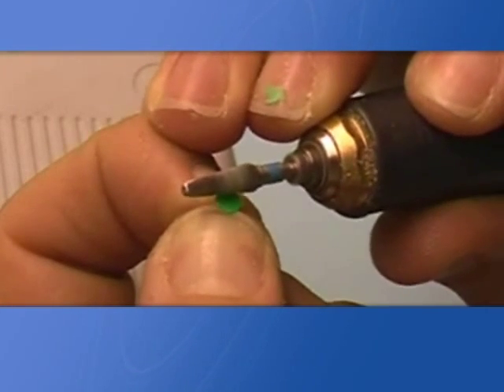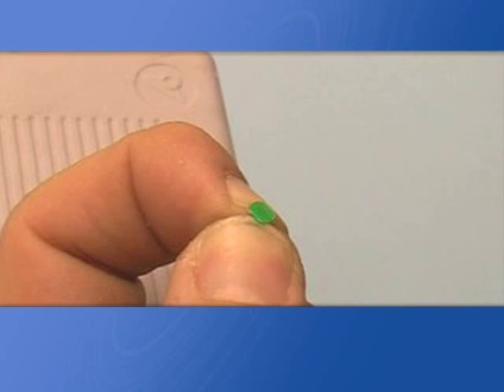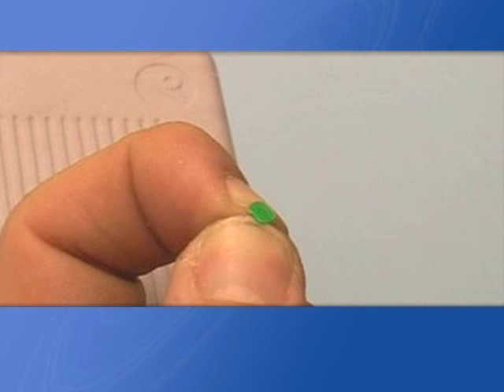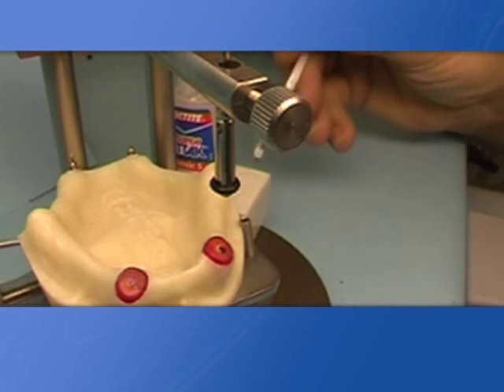It's also possible to reduce the thickness of the sphere base, being careful not to compromise its shape, since the space between the retentive cap and the sphere's base is necessary for the correct functionality of the attachment. Gluing the sphere to the cover will make future steps easier.